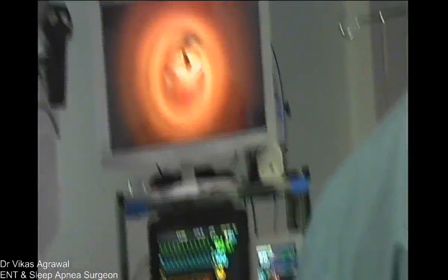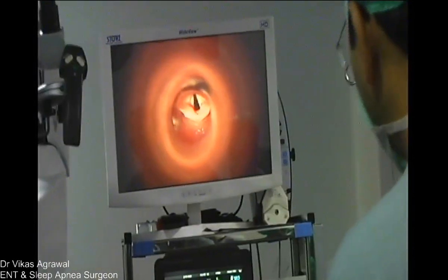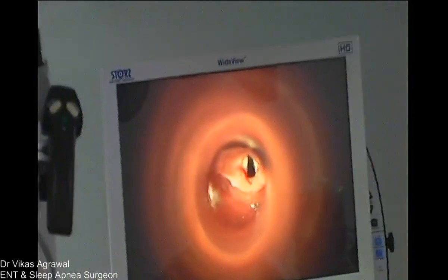Okay. If you are able to see now, Dr. Kalpesh is already onto the cords. Without any maneuvering and under vision, he is passing in the tube. So this makes the intubation very, very easy and predictable every time. Next case, we have a tongue base. Okay, so we can come back. The intubation is already done. Okay, perfect job again.